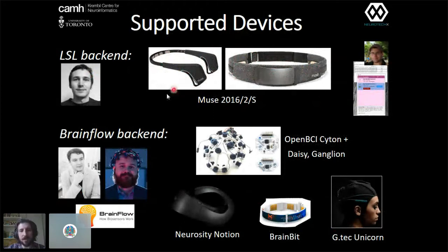But as I mentioned, as of relatively recently now, thanks to BrainFlow, and particularly thanks to Andrei and Jadin, who developed BrainFlow, and then Jadin, who took BrainFlow and implemented it in EEG Notebooks, we now have a wide range of device support. The main focus in this area has been OpenBCI, and we've actually been working with some great folks at OpenBCI to develop the tools, and also to get the message out and do some interesting research studies. This is kind of on the horizon.